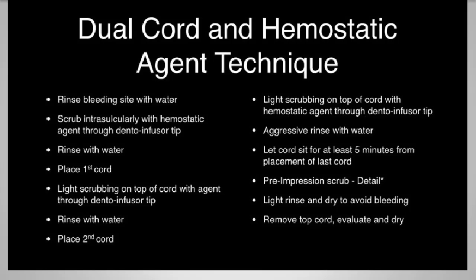At this point, we let that sit for about 5 minutes. The reason we pick 5 minutes is that 5 minutes tends to be the sweet spot between proper retraction and minimizing any kind of tissue necrosis. With patients that have thick tissue, we can really get away with almost anything. Thick tissue is very, very resilient to any kind of cord packing, laser usage, etc. Thin tissue, on the other hand, is not quite as resilient. So at 5 minutes, the literature shows between 4 and 5 minutes is kind of the sweet spot where we get proper retraction without tissue necrosis. As we let the cord sit in place, you may choose to utilize an optional pre-impression scrub.